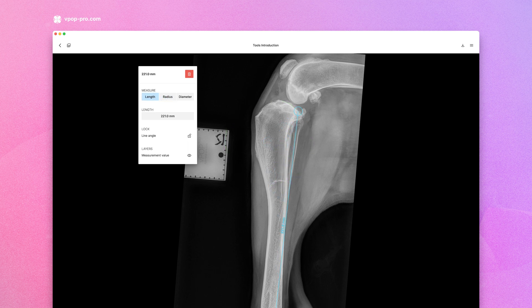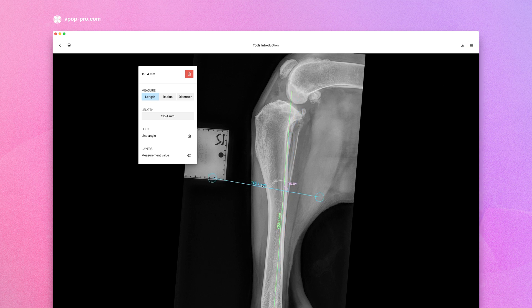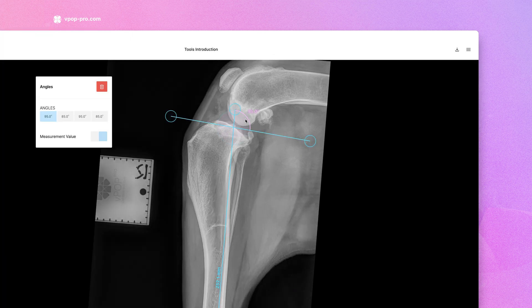Now move the circle center to achieve the best fit. To measure an angle, define one axis then add another line. At any intersection, vPop will automatically display the angle quadrants.